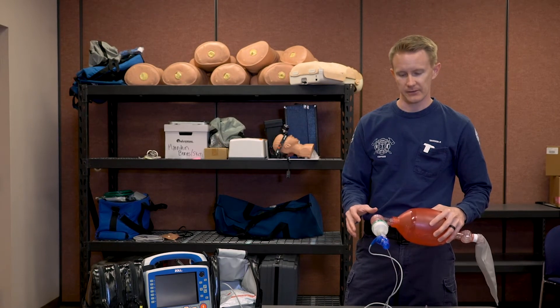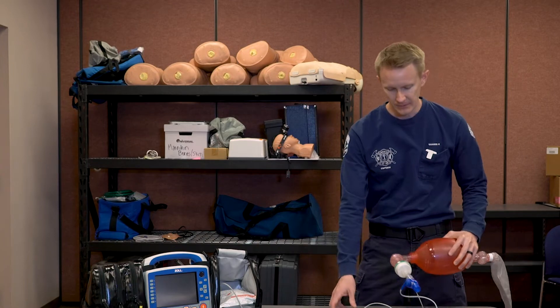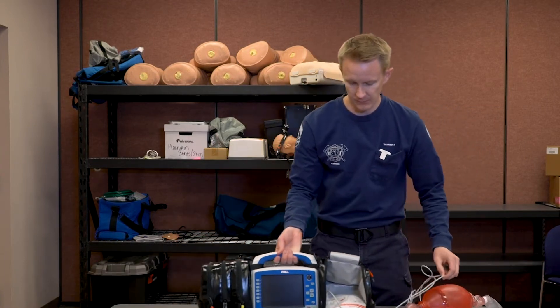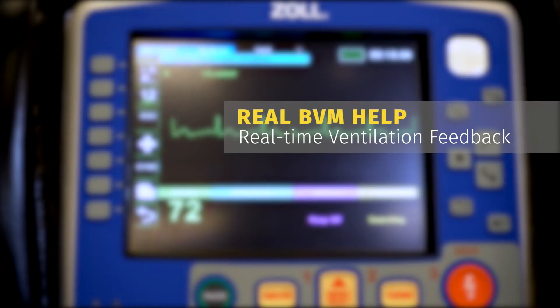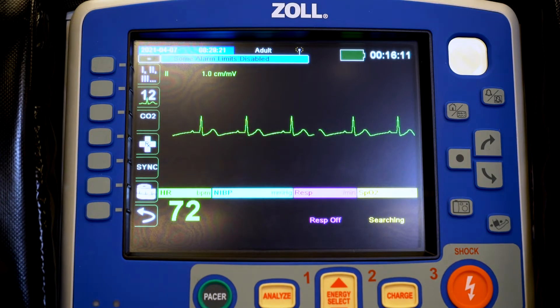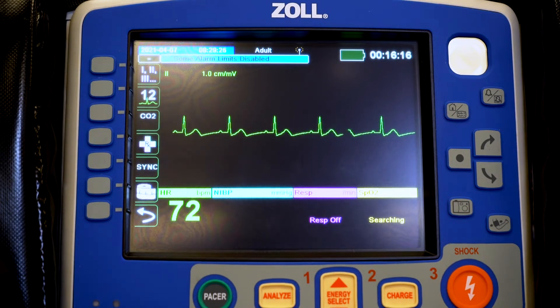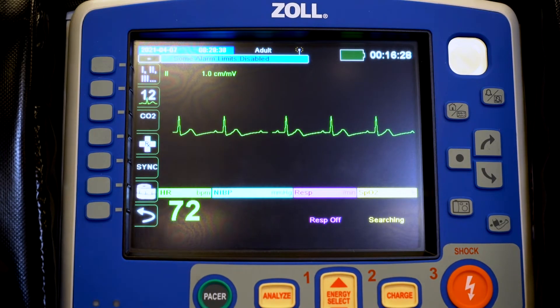Now that we've shown you the basic layout of the AccuVent cable and connection with the flow meter, we're going to show you how the real-time BVM feedback and TBI features are displayed on the monitor. With our ZOL X-Series Advanced turned on and our real-time BVM feedback cable attached to our patient on an ET tube or supraglottic airway such as our iGel, there are no buttons to press to initiate the real-time BVM feedback feature. It simply starts as soon as we squeeze our bag for the very first time.